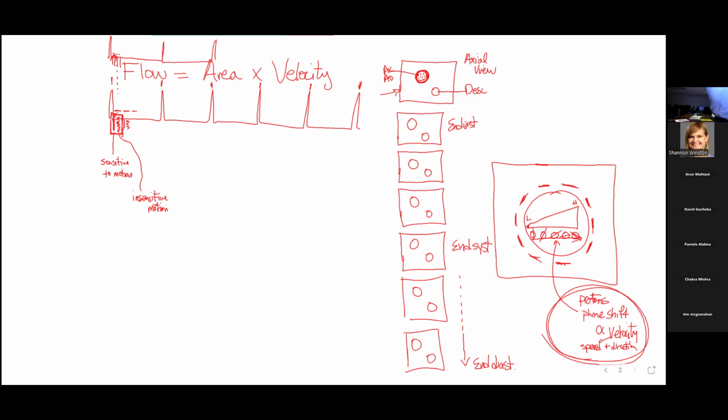Well, to make one phase map and another phase map, but then we have to put those together to get our velocity map. So the way this works is you're going to get a group of these, two of them together, and that goes to make your first row, right? So you can have one here, and there's our next line, right? But what you need to be thinking about is that your TR, or your ability to get a temporal resolution, falls a little bit because you've got to combine two of these, okay?